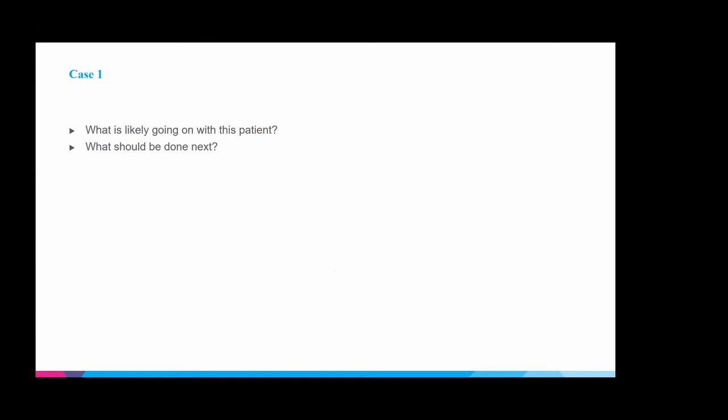If this is atelectasis or even pneumonia, what else could we potentially do that might help the patient? So I see ordering a chest x-ray. Yeah, absolutely. I would still order the chest x-ray, even though we ultrasounded the patient.